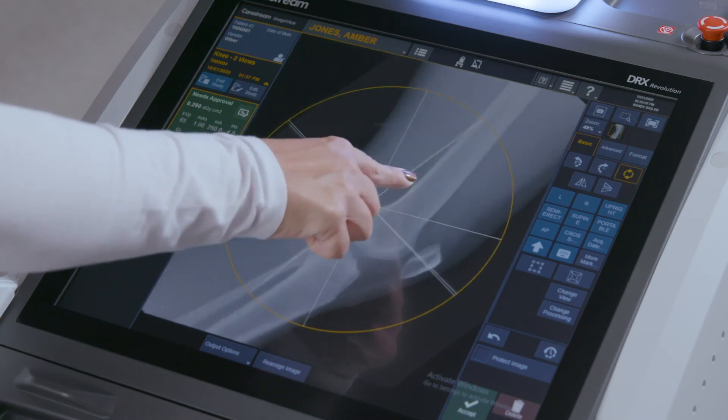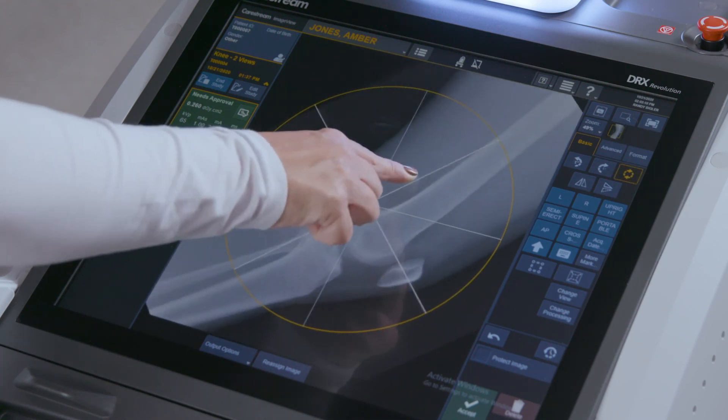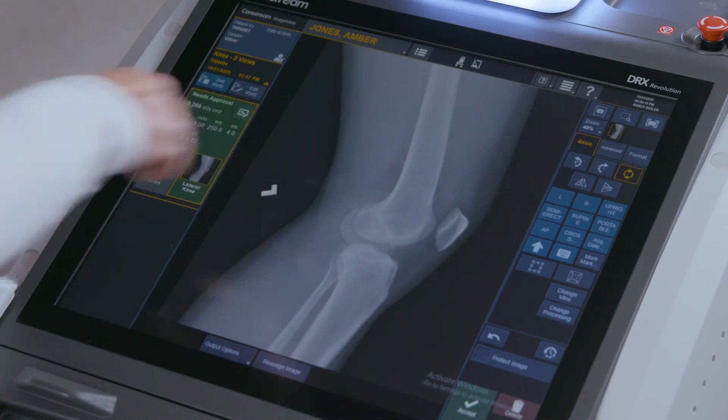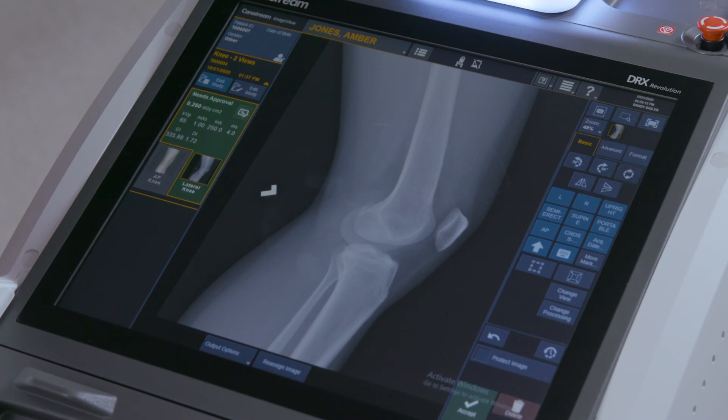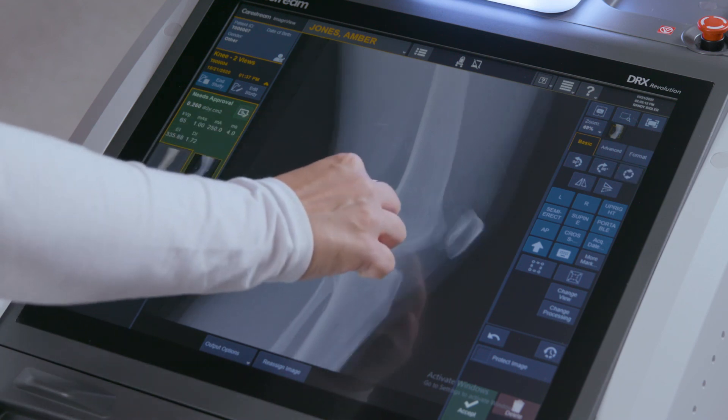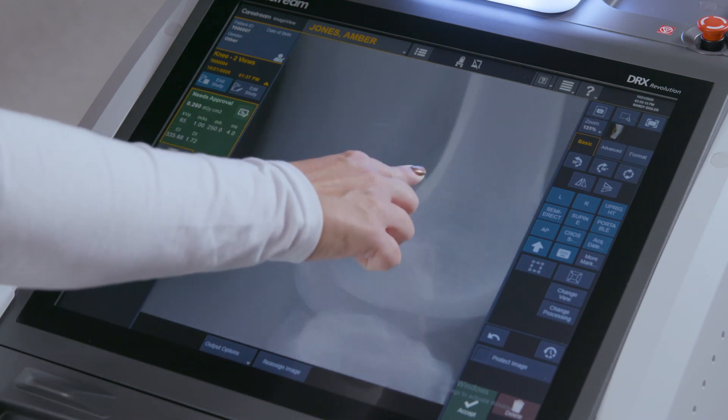The monitors have increased responsiveness to touch. Using two fingers, you can easily rotate the image or zoom in on an area.